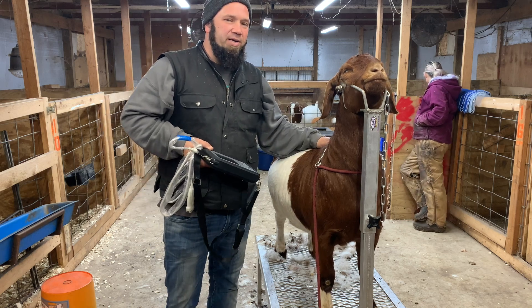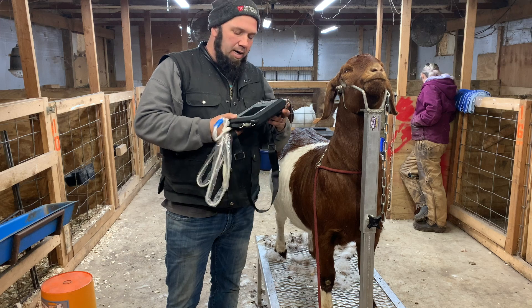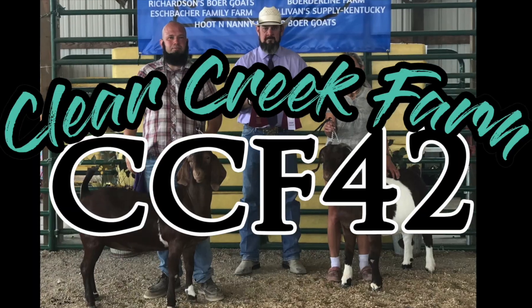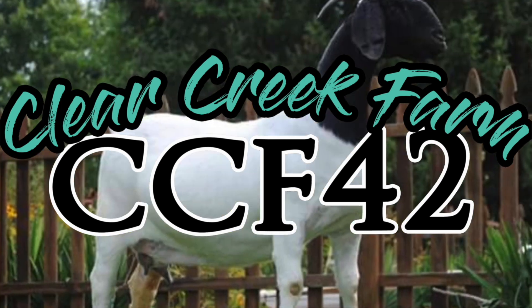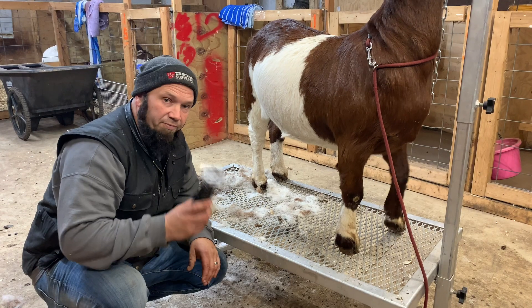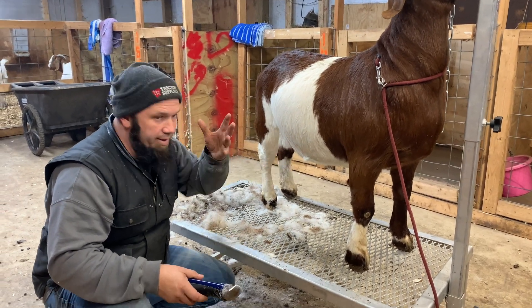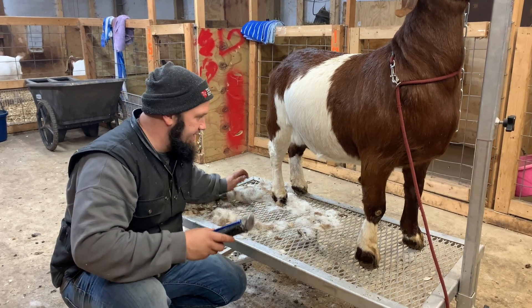Jason here at Clear Creek Farm. Today we're out here using the Valore store ultrasound machine to check some does. The first thing we want to do is shave down here on their belly so that way the probe gets better contact and makes it a little easier to see.